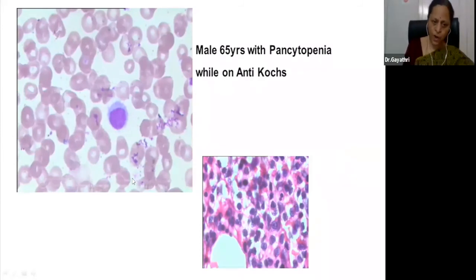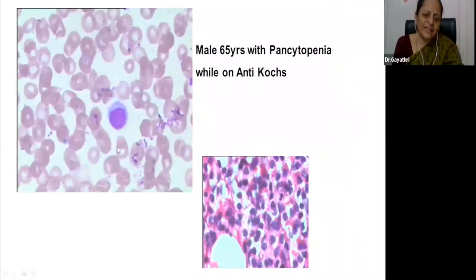I don't know how many of you would have seen a classical case of hairy cell leukemia. The trephine section looks like this, a fried egg appearance, that is, the nuclei of the cells are separated by spaces in between, and this is how a hairy cell will look. Maybe one way to learn to pick up hairy cells is you pick up a case of hairy cell leukemia identified on trephine biopsy, and then go look at the smear, and then you will pick up these hairy cells.